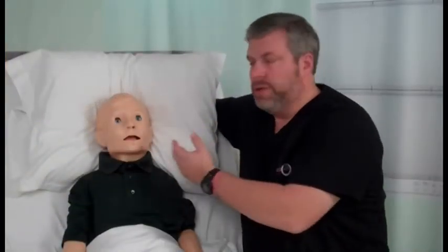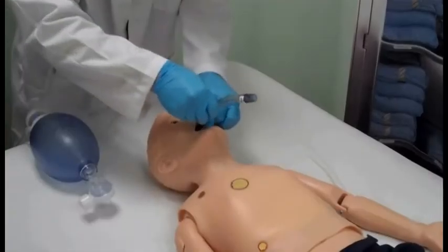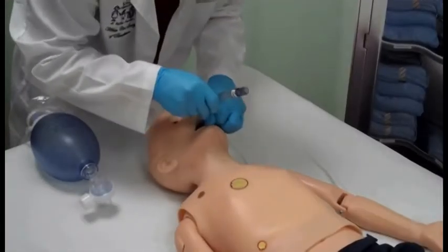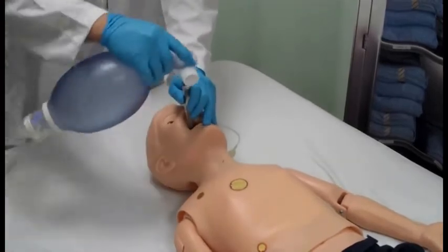When placing a nasopharyngeal airway, you can measure the size of the nasopharyngeal airway as per usual routine. When using a laryngeal mask airway, a size 2 or 2.5 works best. Mouth-to-mouth resuscitation without a barrier device is not recommended, as it will contaminate the airway. So please treat Ralphie with the same precautions that would be used with a real patient.